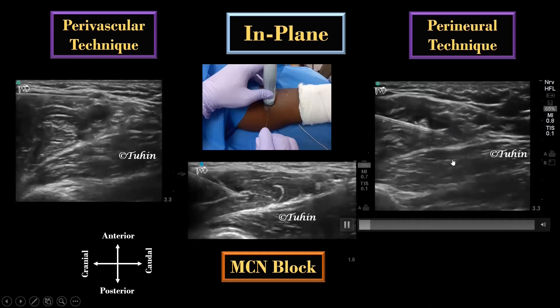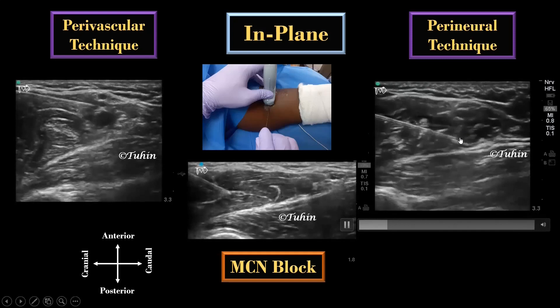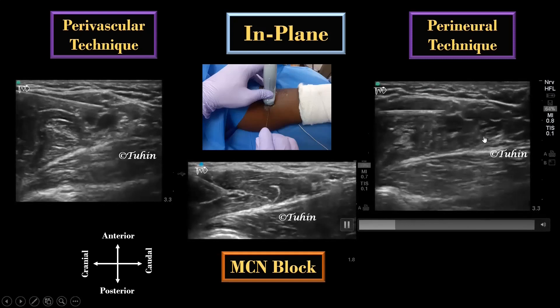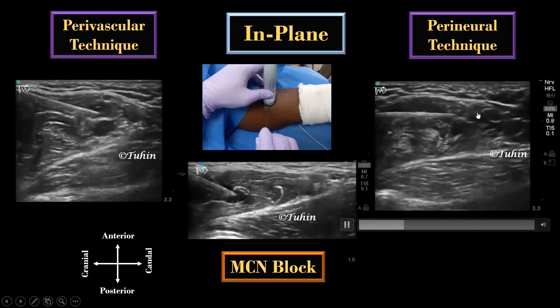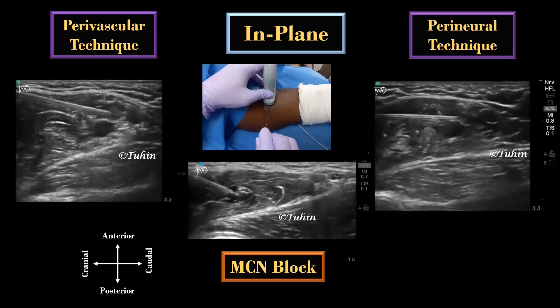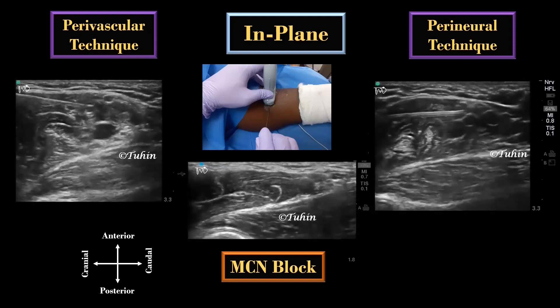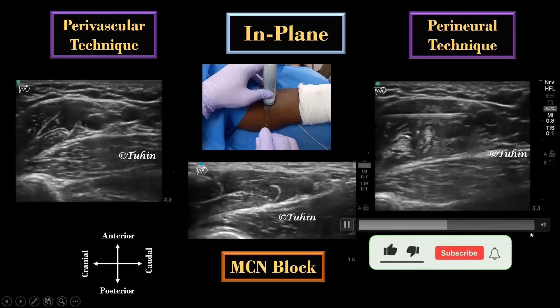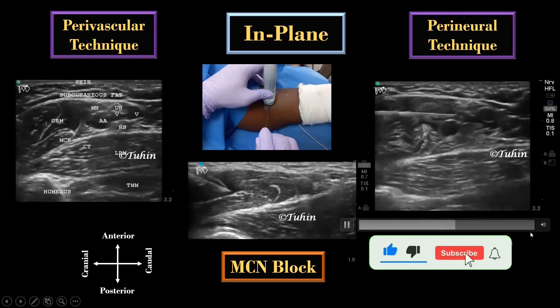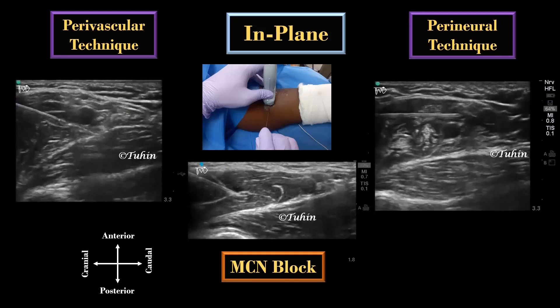In the perineural technique, as you can see here, the individual nerves are targeted. The radial nerve is targeted first — as you can see, it is being lifted up — and then the median and the ulnar nerve. The acoustic enhancement artifact posterior to the axillary artery is often misinterpreted as the radial nerve. Use of nerve stimulation is highly recommended here to identify the individual nerves as well as to avoid intraneural injection.